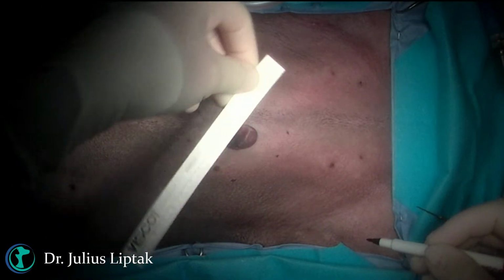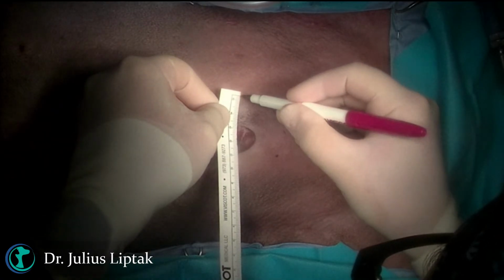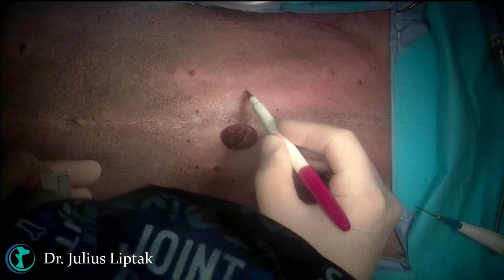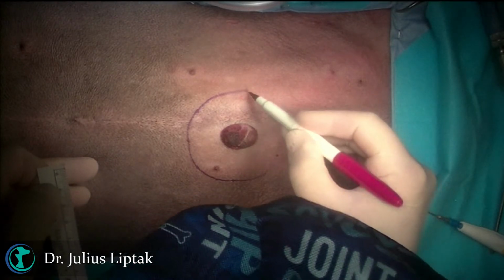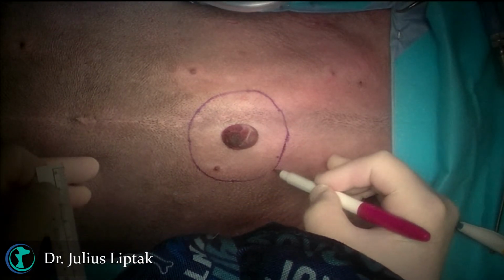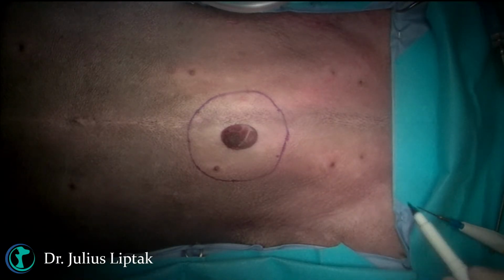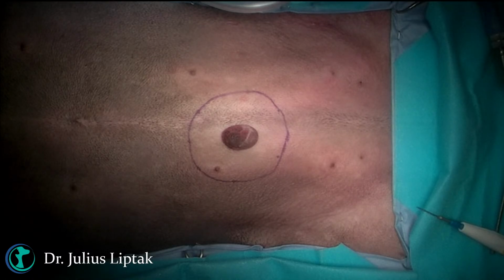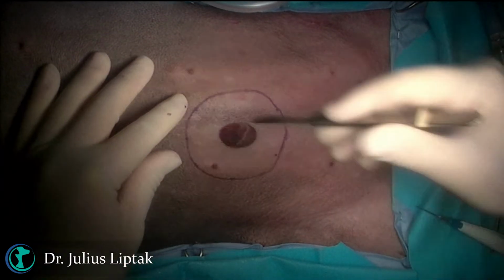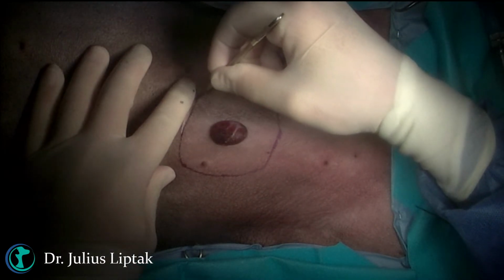Because it's arising from the skin, the margins are in the skin, whereas if this was subcutaneous, we'd be doing it from the subcutaneous margins. And the other thing you'll notice is I do a circle, so I don't resect these with an ellipse, which is something that we're doing more and more, if we don't want to take more tissue than we need to.